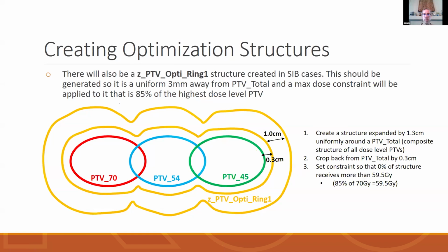In all actuality, you'll see Brendan later in this presentation give a brief introduction to actually optimizing sort of live. And you'll see that the hardest part of this planning process is creating the contours. But once you actually get these contours created, as Brendan stressed throughout, there are no conflicting arguments. So whatever planning system you use, if you know exactly physics-wise what can be achieved and you create contours based on that, it becomes extremely easy to plan.